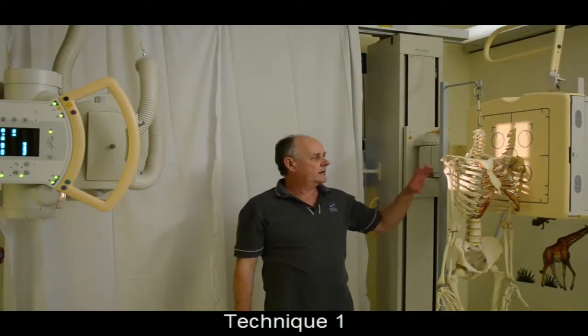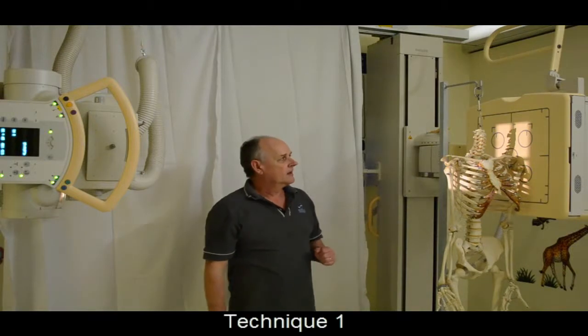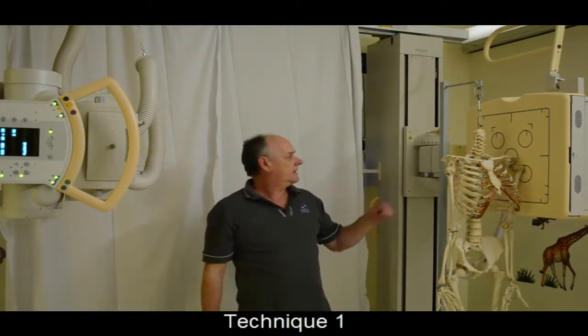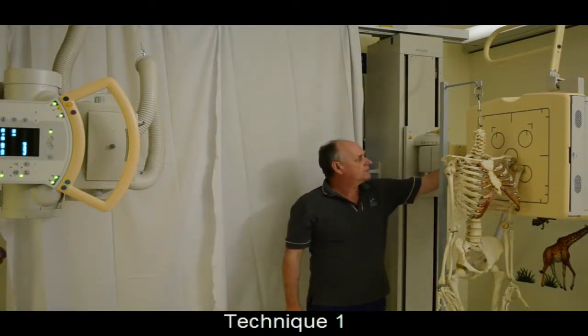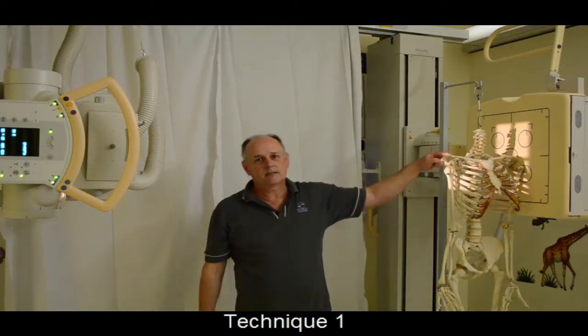In lateral cervical spine imaging of a dry skeleton, you can see that the central ray is centered to C7.